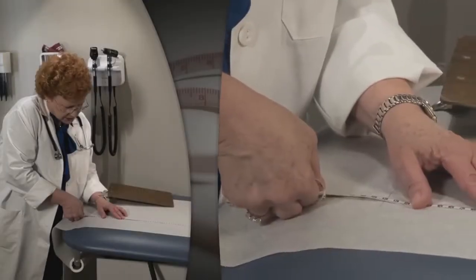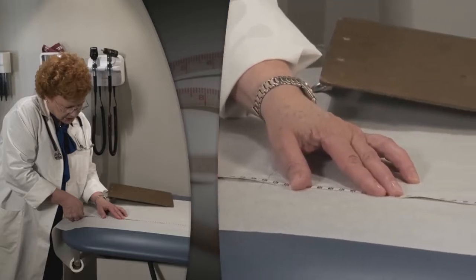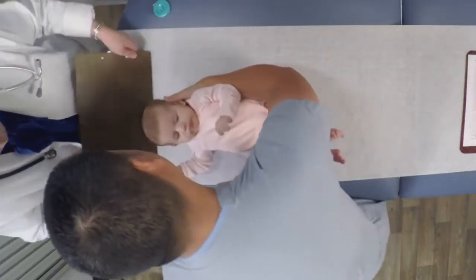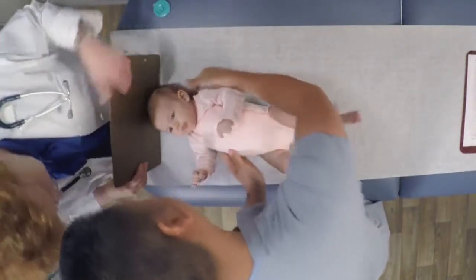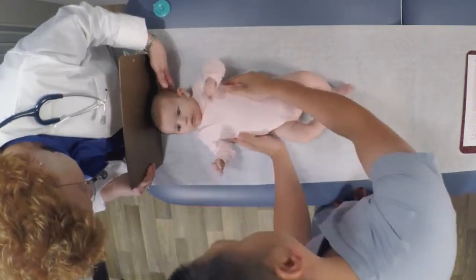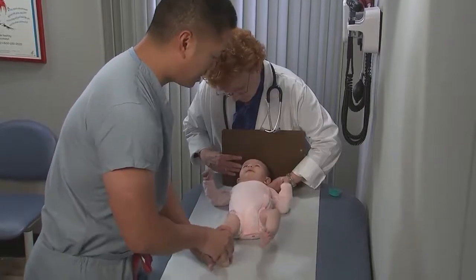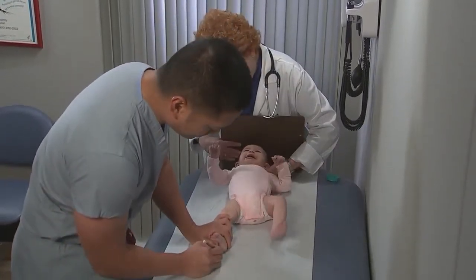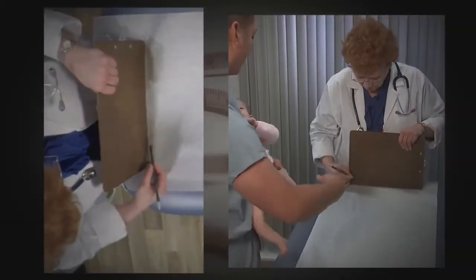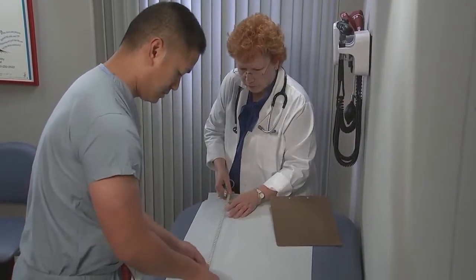If an infantometer is not available, a non-stretchable measuring tape can be used. Positioning the infant's head against a wall or other vertical flat surface is the best way to mark the head position. The infant's legs are then extended as before. The heel position is marked, and the distance from the wall to the infant's heel is measured with the tape.